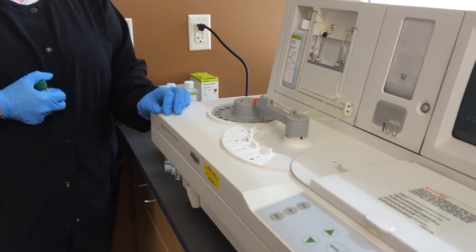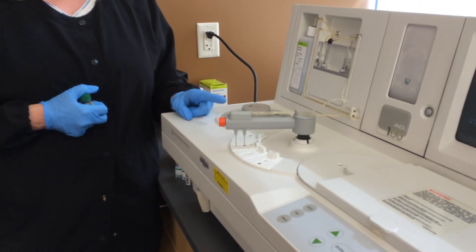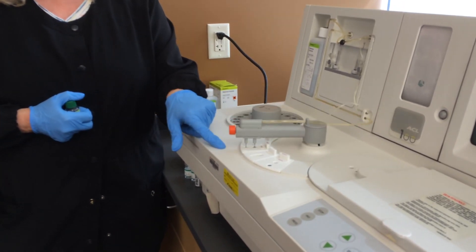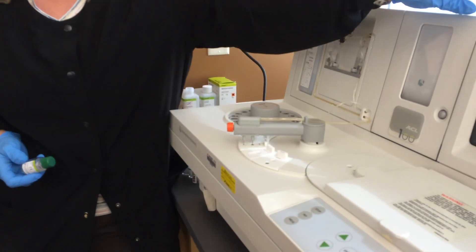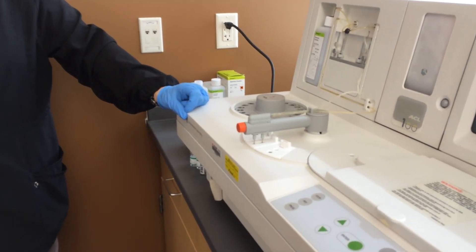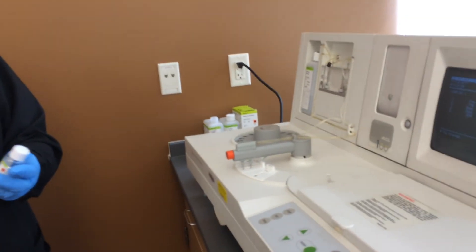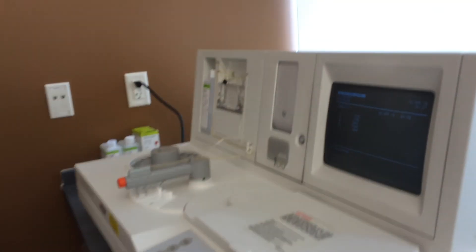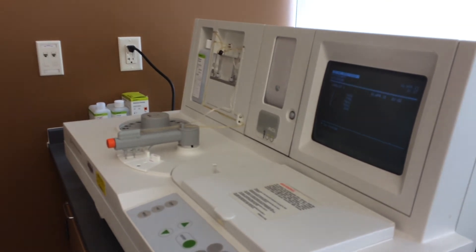It looks like it's going to load the PTTs first. It went to cup number three, took Synthesil and went over to the rotor. Now it's going to go to cup four, get some Synthesil, take it over there. The name of this reagent is Synthesil; on here it says Cephaloplastin. What's happened over the years is the names of these reagents have become quite long. 33 years ago we used to call this thromboplastin and pretty much all bottles said that. Now there are all different kinds of names — Recomboplastin, and over here — Neoplastin? So PT reagents can have a lot of different names.